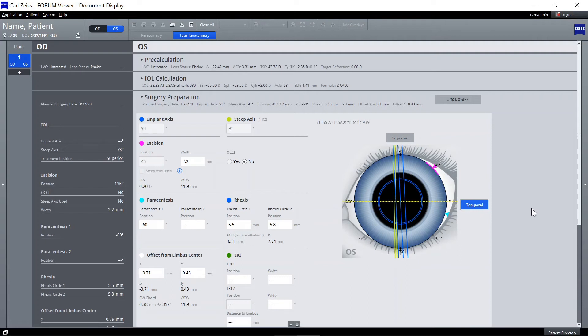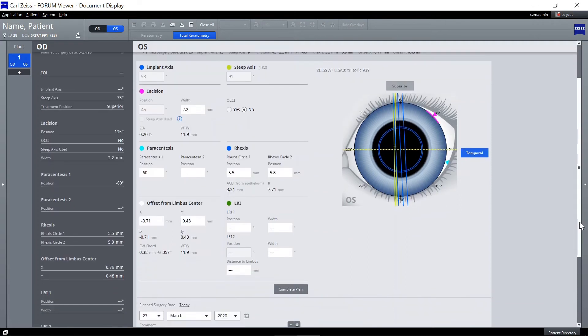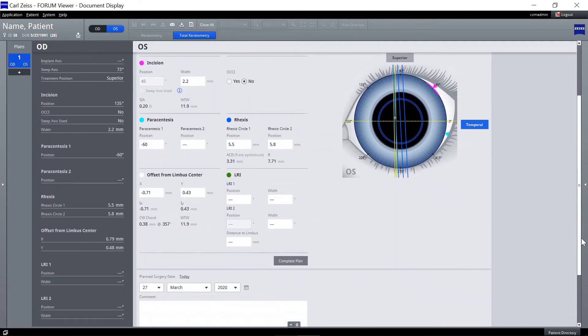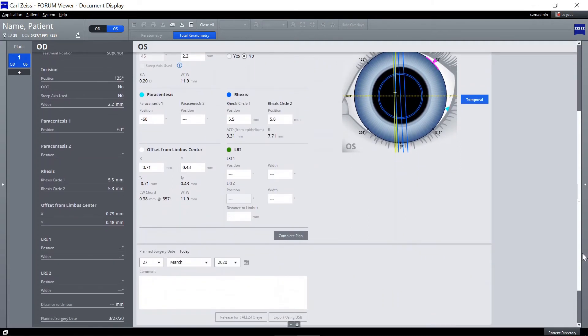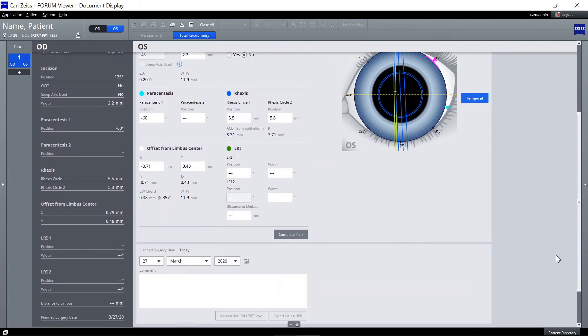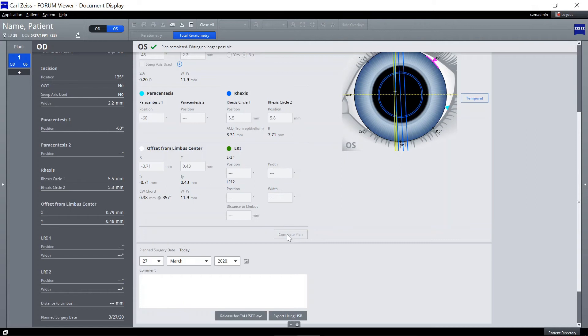By the way, you may interrupt your planning at any time and restart again at the desired step. Click the complete button to finally save the plan for the currently selected laterality.